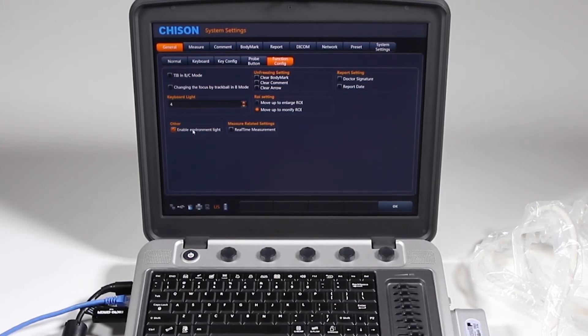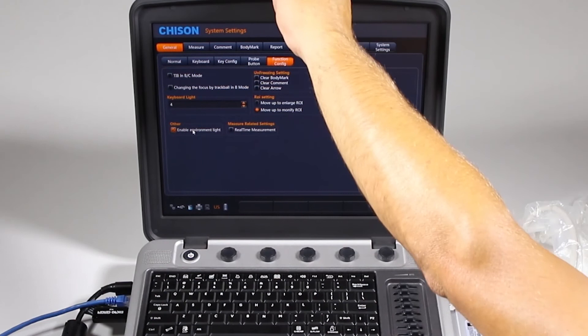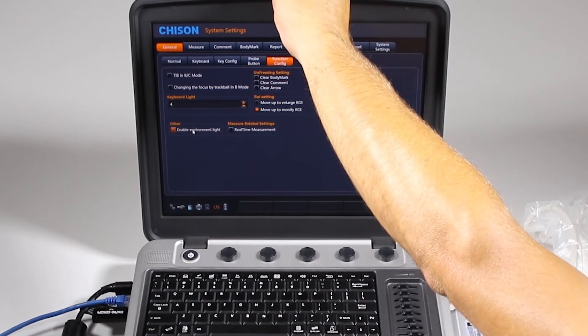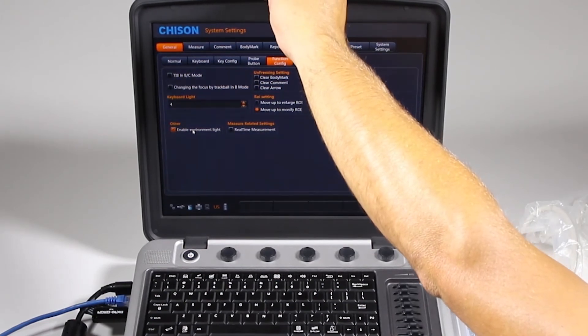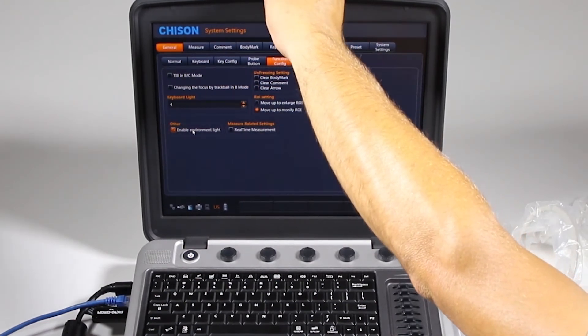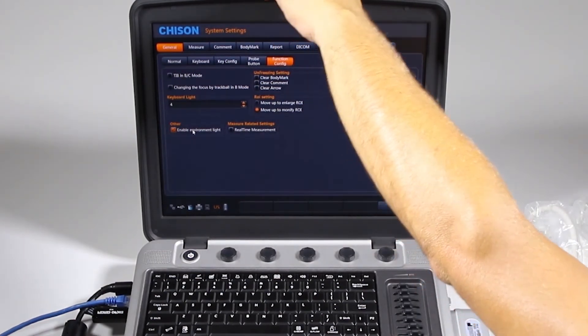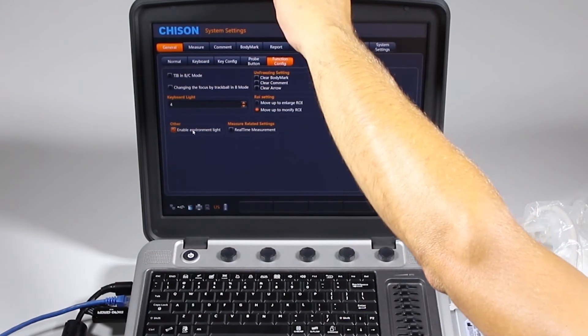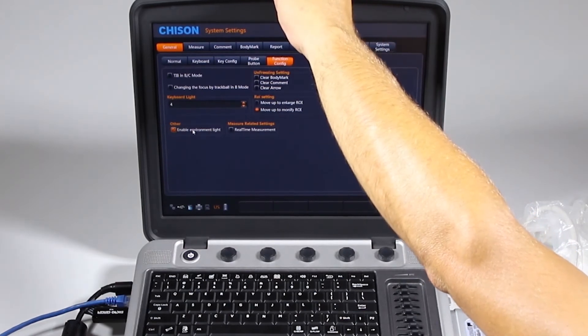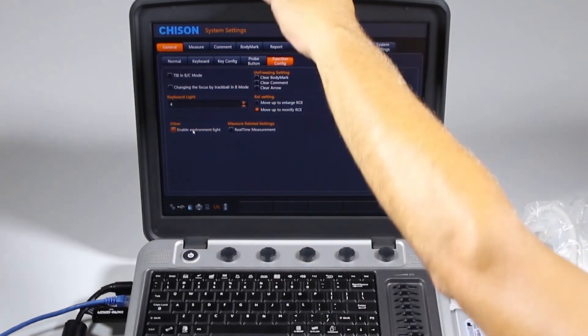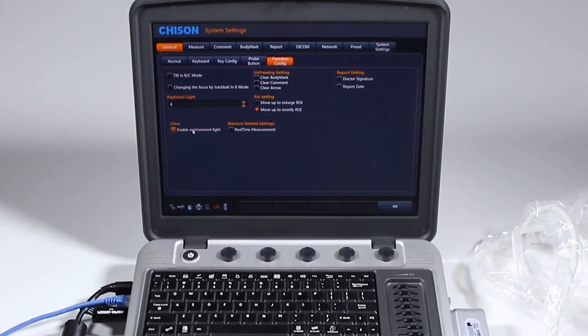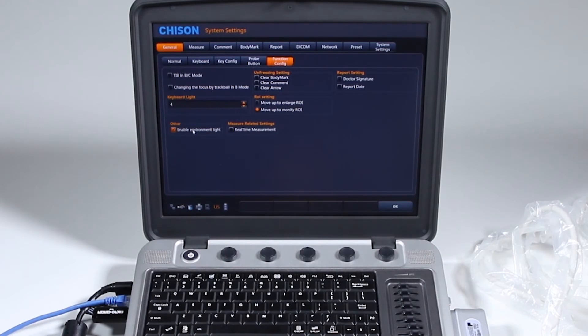Enable environmental light, this is an environmental light that is here. If you cover it up, it'll go darker, see, and then you undo it, it goes brighter. I don't know if that can be seen on the video or not, but you can turn that off so the screen doesn't change.